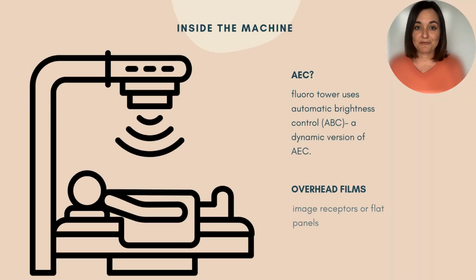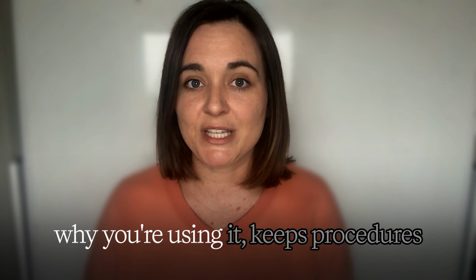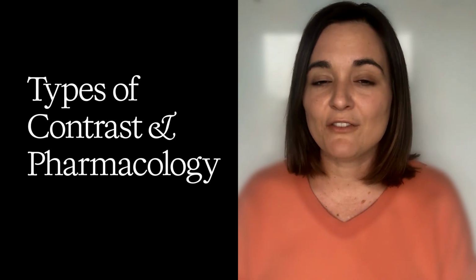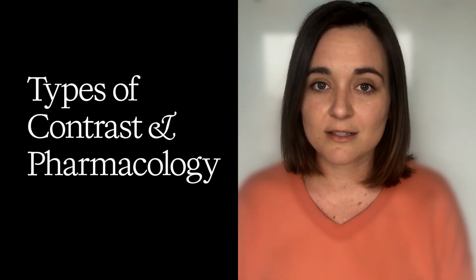Do we use AEC in fluoro? Yep. Your fluoro tower uses automatic brightness control, or ABC. This is a dynamic version of AEC. It adjusts your kVp and your mA in real time to keep image density consistent, even as contrast fills or the patient shifts. Having the right gear and knowing exactly why you're using it keeps procedures efficient, safe, and diagnostically useful. This section touches everything from equipment operation to quality assurance and imaging informatics.